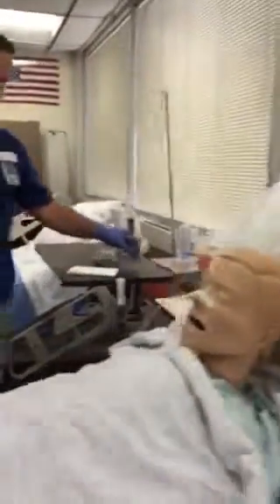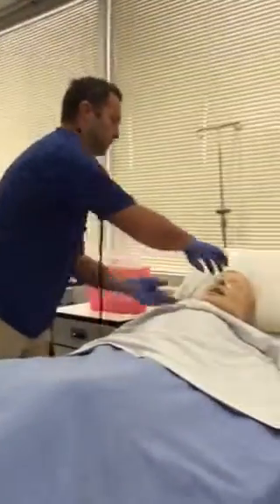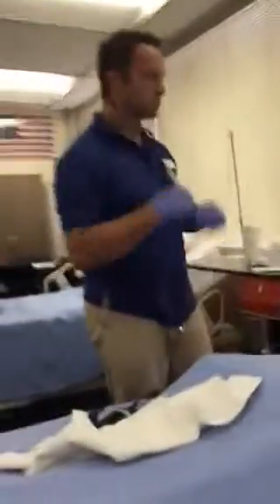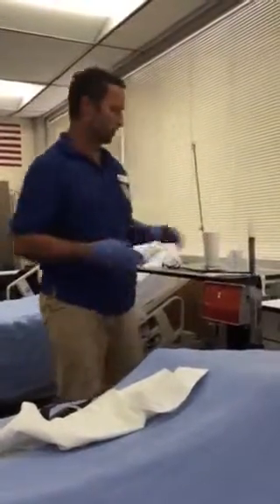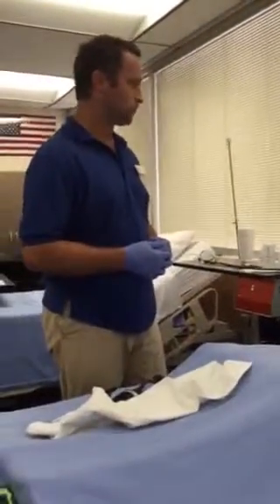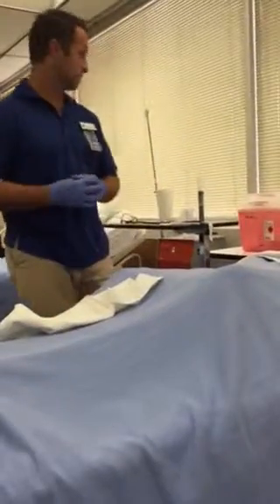Now, we'll take the stomach contents, and we want to pay attention to how much of the stomach contents we did get out. We're going to want to document that as we complete our medical records for this patient. We're going to want to mention the amount of contents that we did withdraw, the pH of it, the consistency, the color of it. And we'd probably honestly be seeing a little bit of a solution in the intermittent suction vial by now, I suppose depending upon his stomach contents.